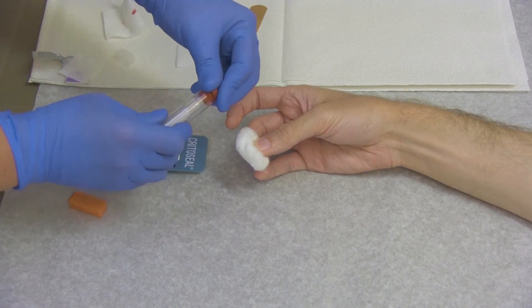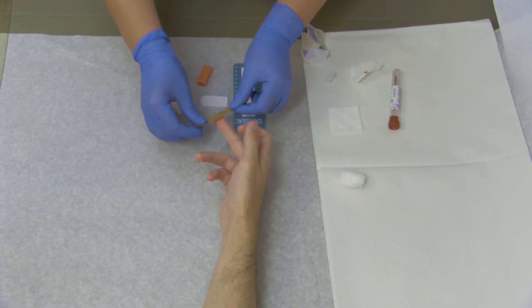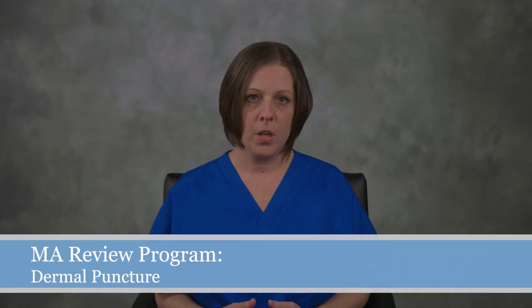Accurately document the procedure and complete the laboratory requisition in the presence of the patient. Check the patient's puncture site, answer any questions the patient may have, and release them. Follow your lab manual instruction for processing or pickup of the specimens.